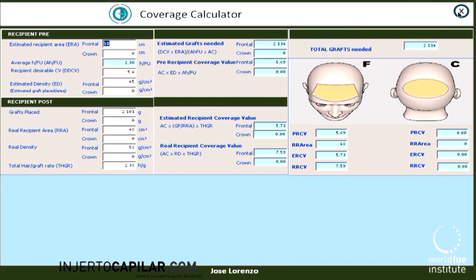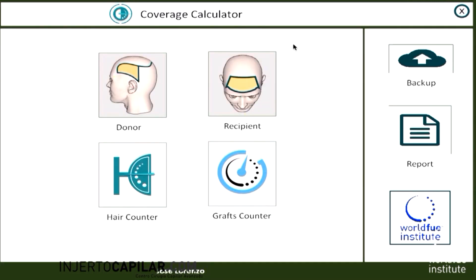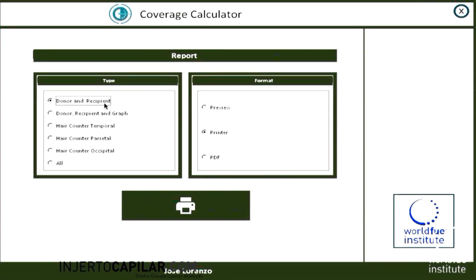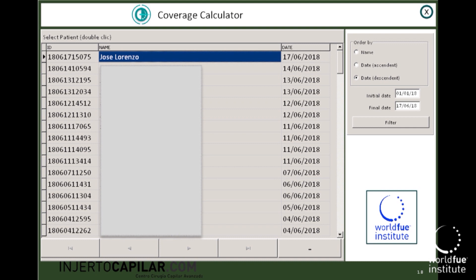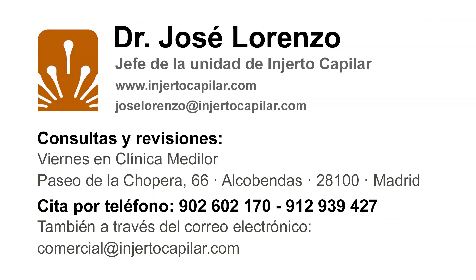When we finish with the patient and everything is filled out in the application, we can make a report of donor, recipient, grafts, or whatever you need. We can do it by printing or making a PDF to save or send by email. Your patient will be in the database and you can retrieve them whenever you want. Hope you enjoy it — thank you very much.